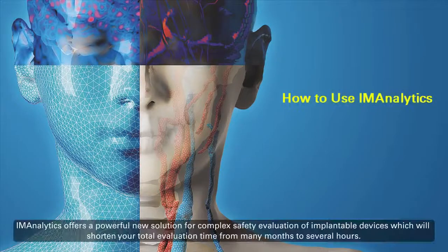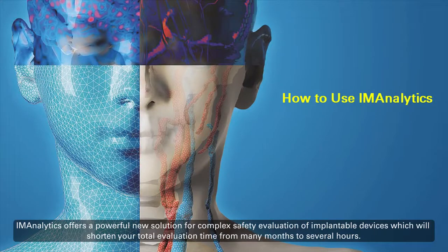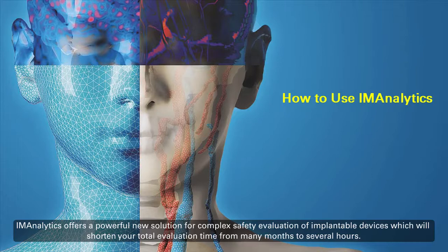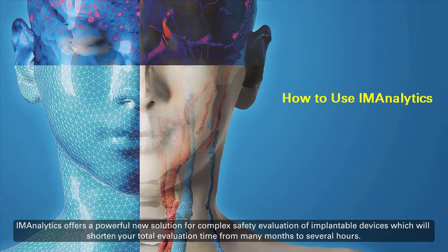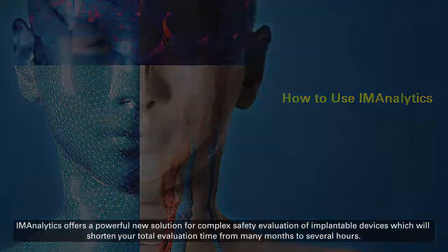IM Analytics offers a powerful new solution for complex safety evaluation of implantable devices, which will shorten your total evaluation time from many months to several hours.